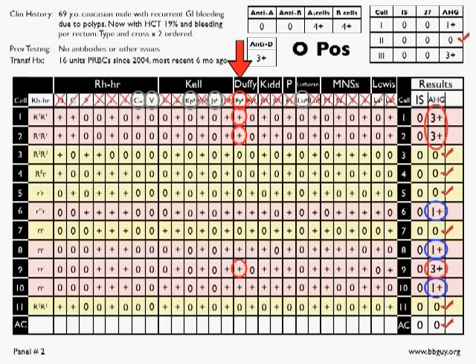In cells 6, 8, and 10, we have single dose expression of Duffy A. That corresponds with the weaker reactions of Duffy A. And that certainly does go along with the fact that this appears to be an anti-Duffy A.